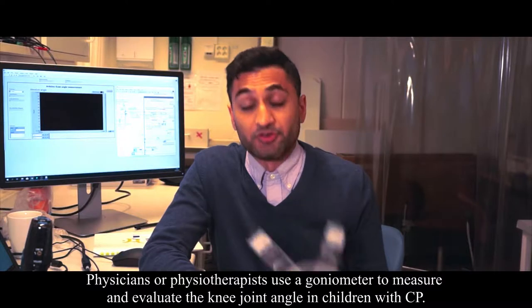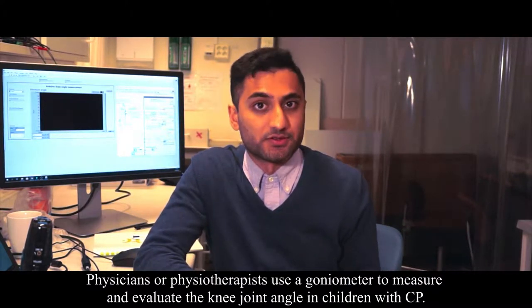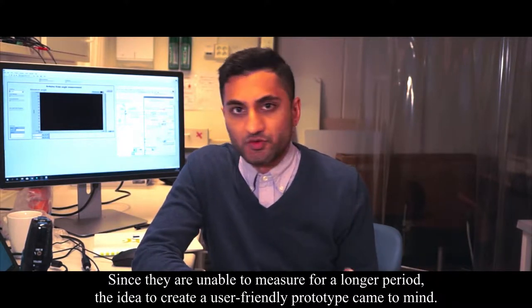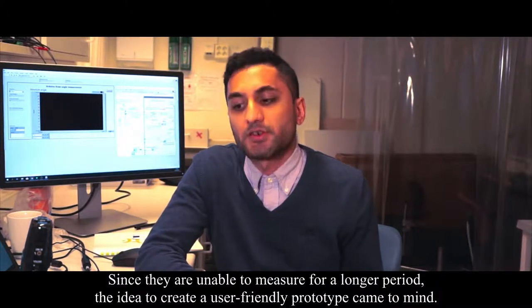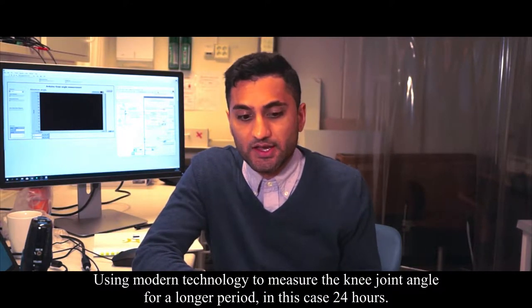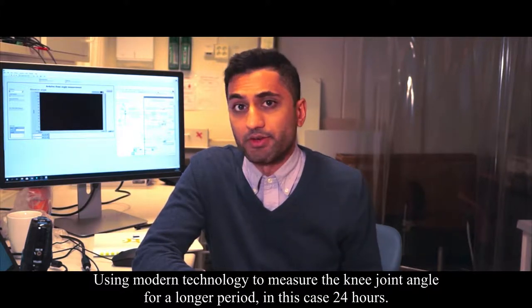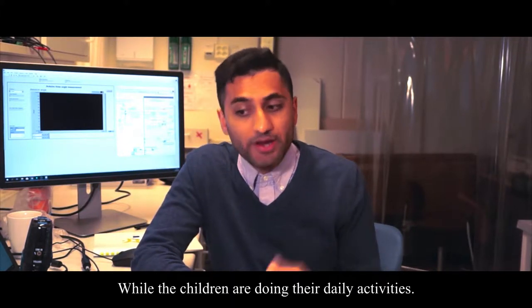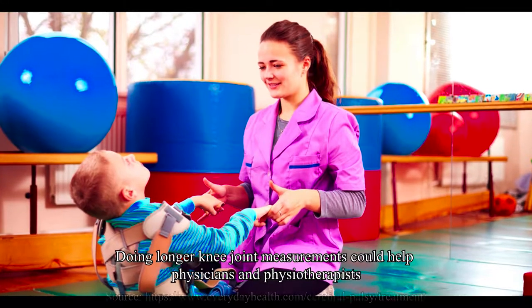Physicians use a goniometer to measure and evaluate the knee joint angle in children with CP. However, since they are unable to measure for a longer period of time, this is where the idea came: why not create a user-friendly device using modern technology that can measure the knee joint angle for a longer period — in this case 24 hours — while the children are doing their daily activities, just having a normal day.